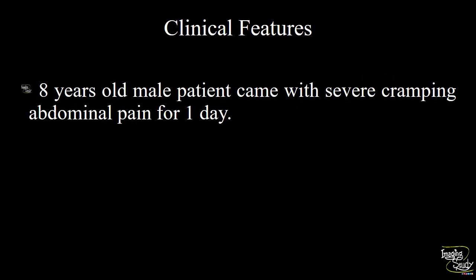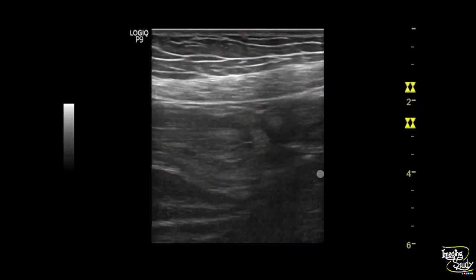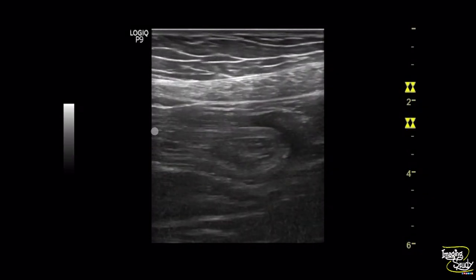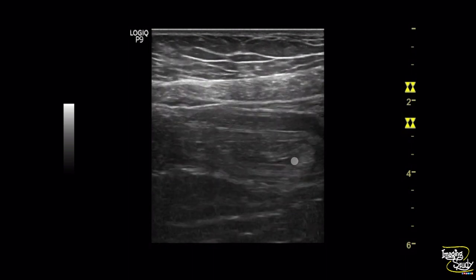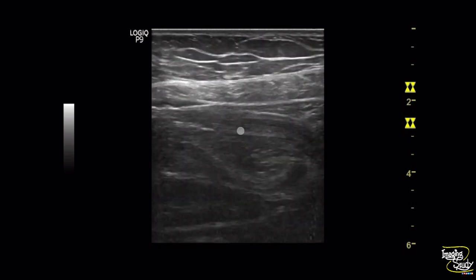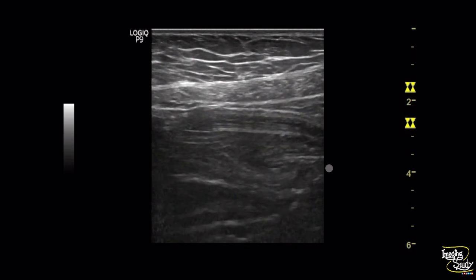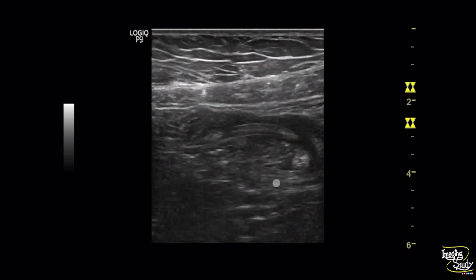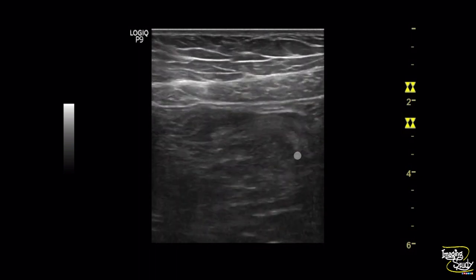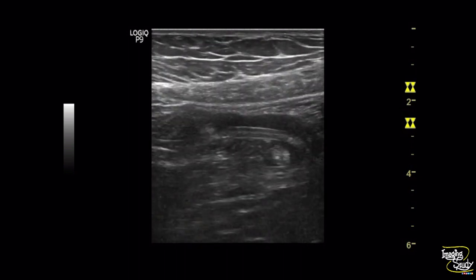Case 4. An 8-year-old male patient came with severe cramping abdominal pain for one day. Here you can see the high-frequency linear scan of the intestinal loops. You can see some tubular echogenic motile structures noted within the gut lumen. These spaghetti- or chow mein-like structures are nothing but worms — that is Ascaris lumbricoides.